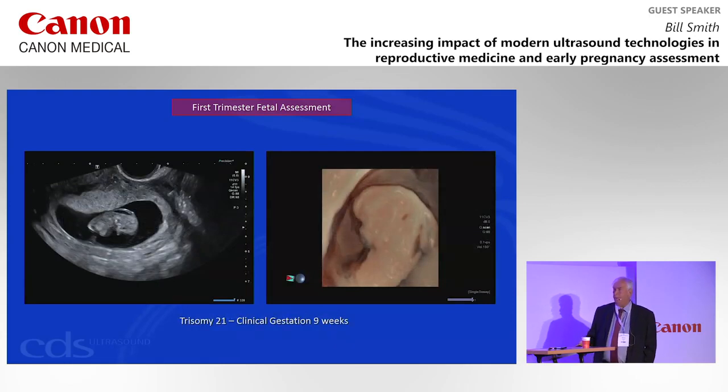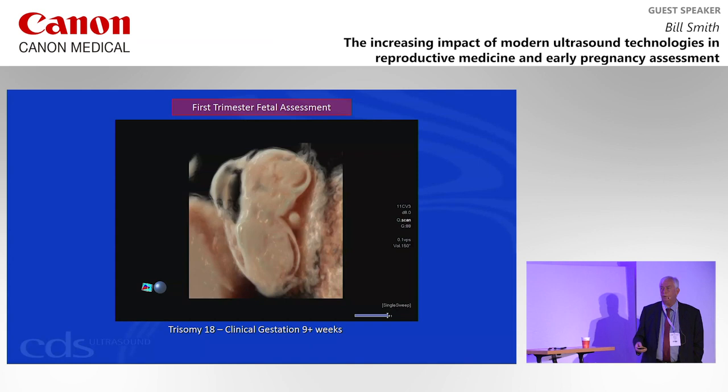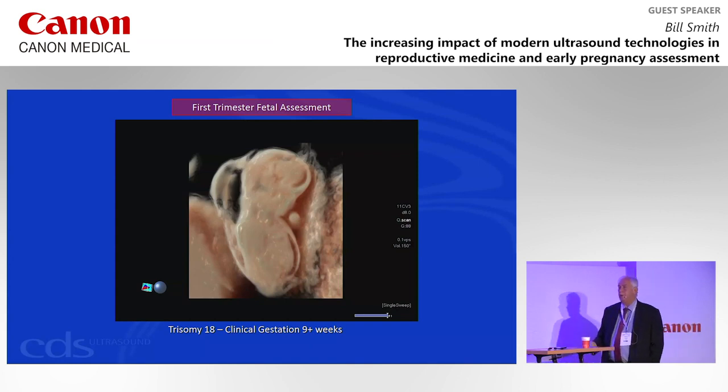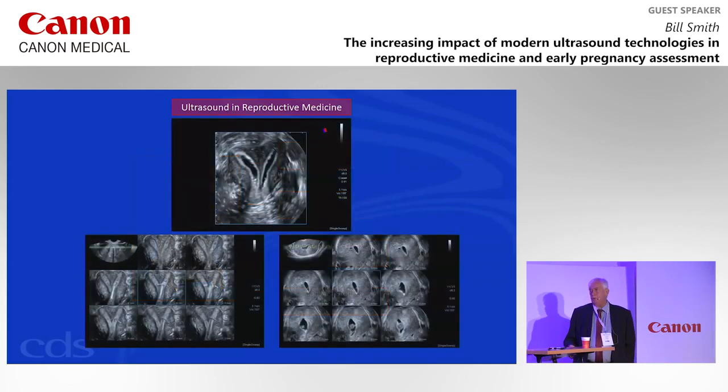And again, the rendered image gives you an obvious picture of an abnormal fetus. So 3D is very important to us. It's not kind of boys' toys. It's important to us from a diagnostic point of view. Let's quickly move on to 3D itself.